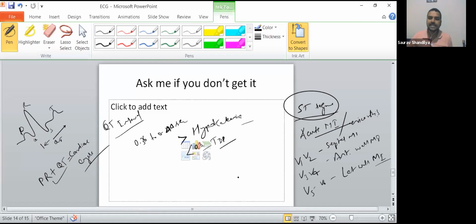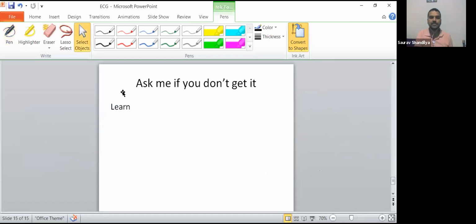Now I'm talking about ST elevation. Elevation should not be normal. Now depression is normally myocardial ischemia. If blood is not supplied properly for a very long time, the ST segment will get depressed. Depressed means it will show a downward trend from the isoelectric line. Got it? That is something very, very important. Because of scarcity of time, I will not go into much detail about it.